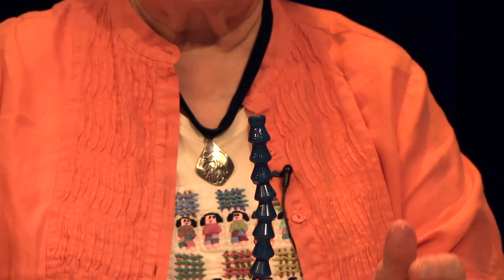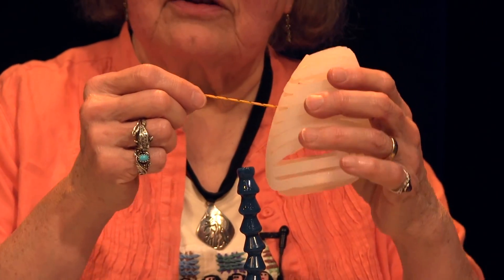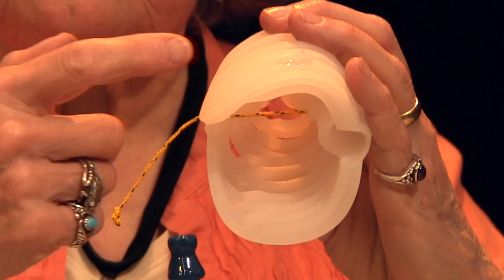Pick up the chest and with one hand, apply tension to the yellow-black cord representing the sternospinal line. This is an imaginary line between the sternum and the spinal column that allows demonstration of chest rotation and flattening.